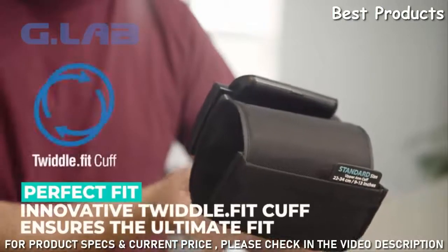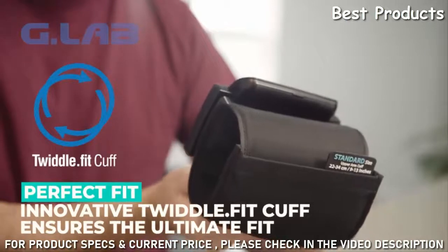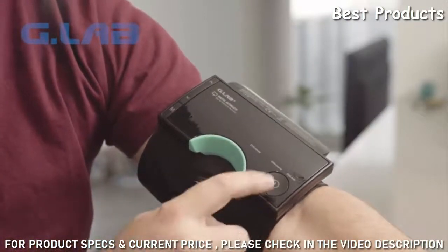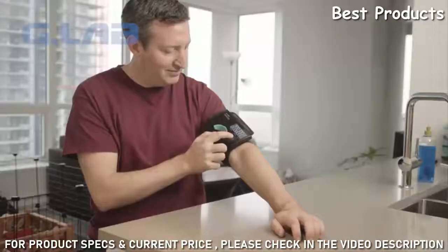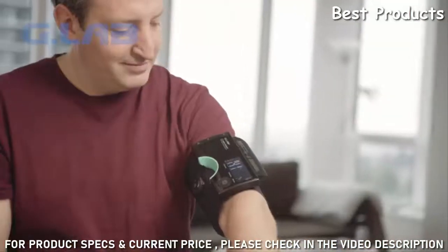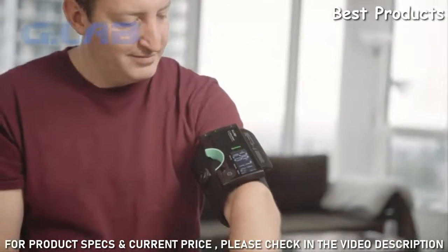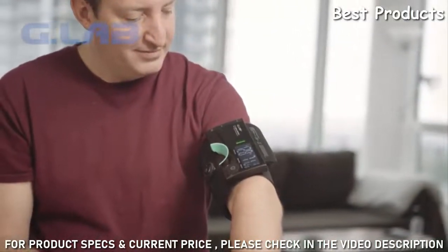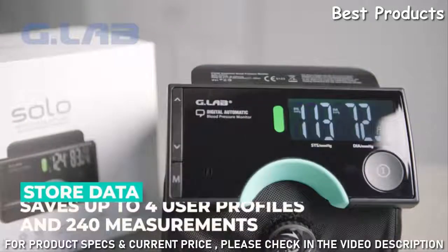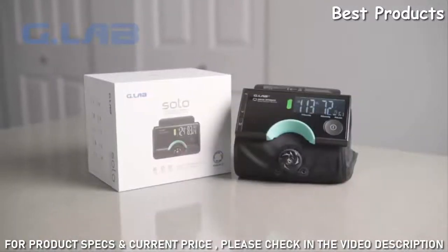Our innovative TwiddleFit cuff ensures the perfect fit. Simply turn the dial until snug and press the Start button to start your measurement. After a few seconds, your heart rate as well as your diastolic and systolic pressure are read out to you. Your data is automatically saved onto the Solo, which supports up to 4 user profiles and 240 measurements on each.